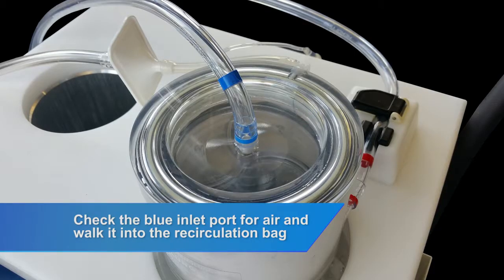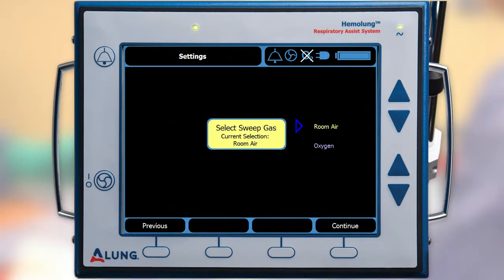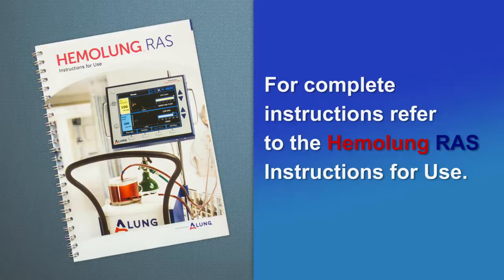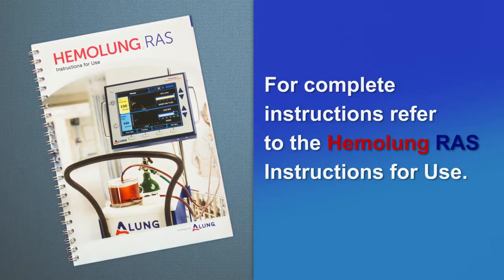Check the blue port on the cartridge for air and if found, walk it into the recirculation bag. Once the self-test completes, press Continue to select the sweep gas source. Use the arrow keys to select the desired source and press Continue. The pump will now run continuously until the patient is ready to be connected. Pressing Next will stop the pump and display instructions for connecting the patient. For complete instructions, refer to the Hemolung RAS instructions for use.